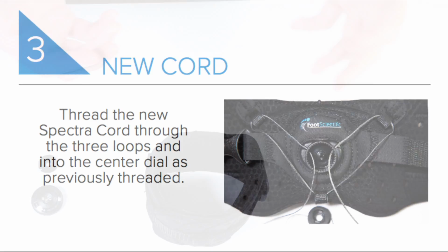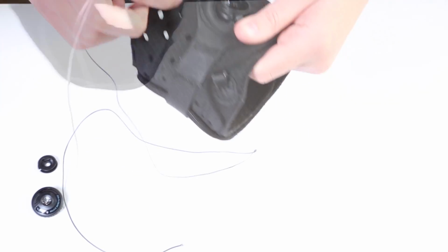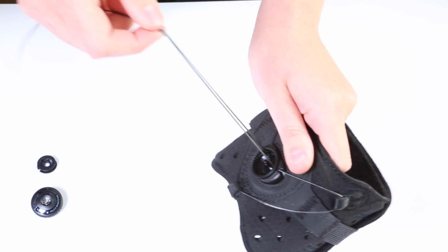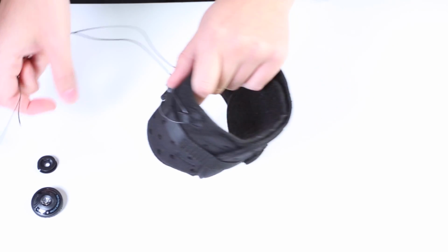Step three, we're gonna thread a new cord. We're gonna go through the bottom, each side, and then into the center, and then through the spool. So now after I threaded it through the 3 loops, I threaded it into the center where your spool goes. Now I'm gonna thread these 2 ends into my spool and tie off the ends.